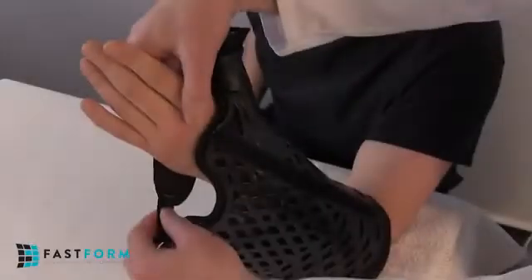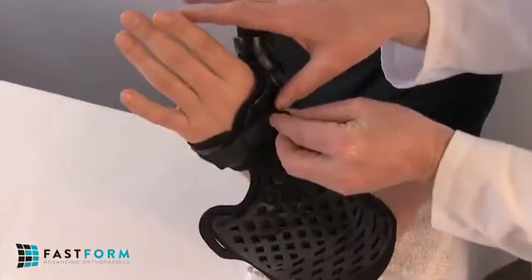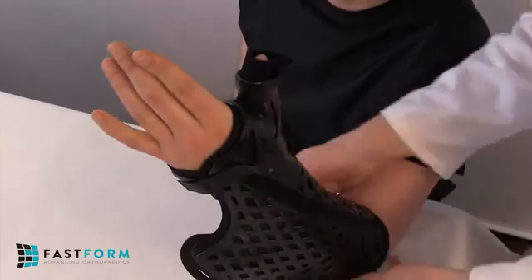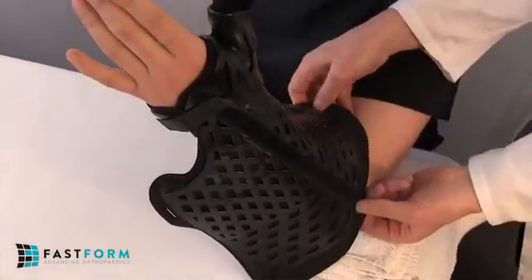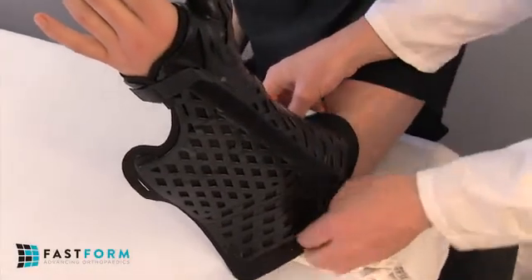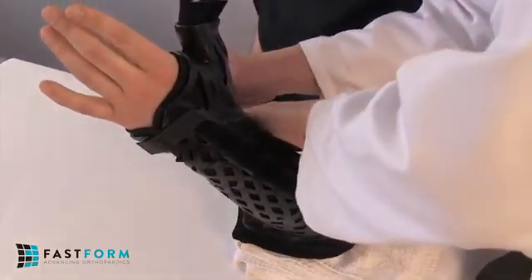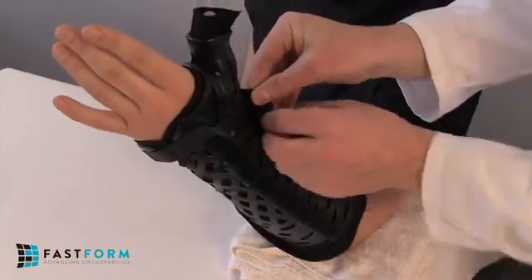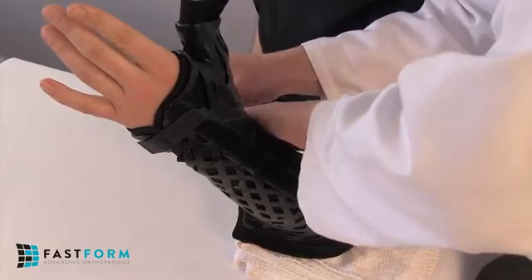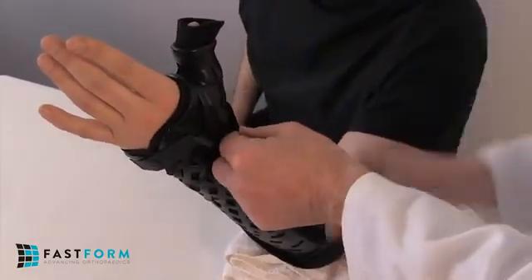Secondly, wrap the palmar cuff around the hand and over the fifth metacarpal, and then fasten the Velcro tab to the radial hinge. Note that wider palms may require a slight stretching to reach the radial hinge Velcro strip. Next, wrap the medial wing around the arm and overlap the lateral wing over its full length. Note that larger forearms may require slight stretching of the medial wing. Before fastening the overlapping wings together with the bandage clips included, reconfirm alignment of the radial hinge along the radius.